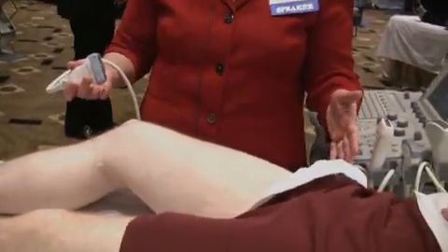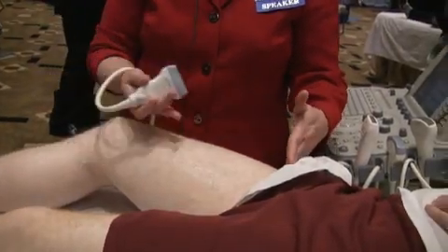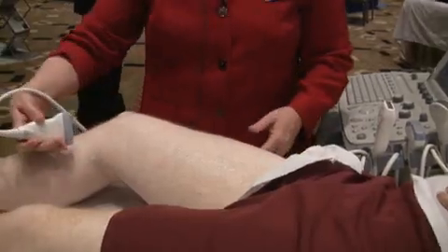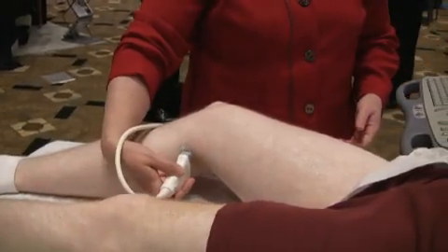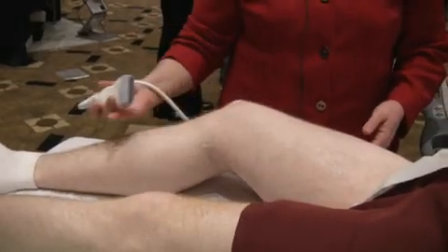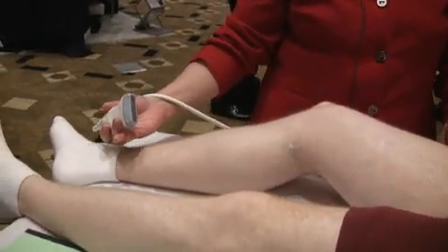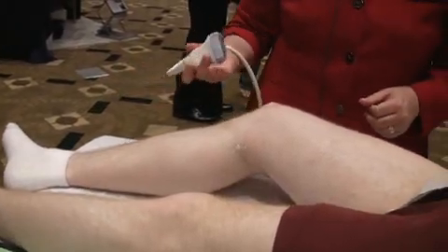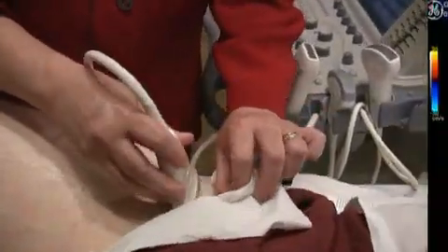From this orientation, we can pretty much see from the common femoral artery up here, down through most of the superficial femoral. Then we'll come behind, more posterior approach here to look at the popliteal, and then continue on down the calf, and we can pretty much see everything from this view. We'll just have to turn the leg when we go and evaluate the anterior tib. But we'll start up here at the groin and orient.